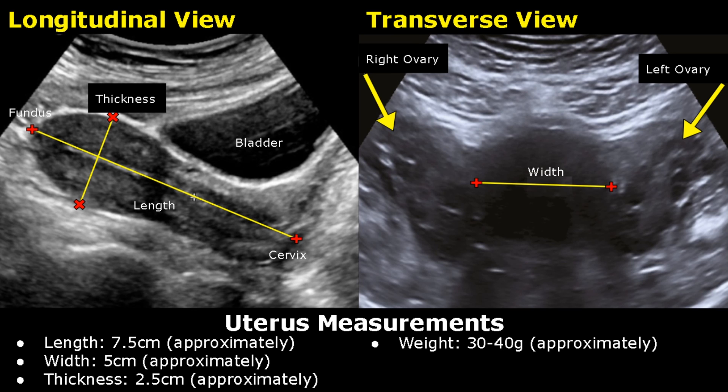Hello everyone, this is Dr. Sam and in this video we will learn how to take uterus measurements on ultrasound. These measurements are of an adult non-pregnant uterus.